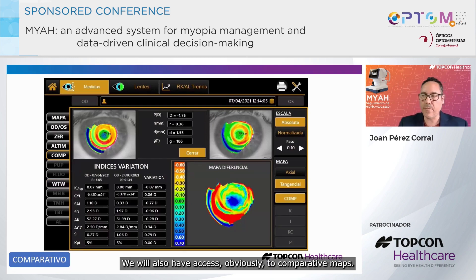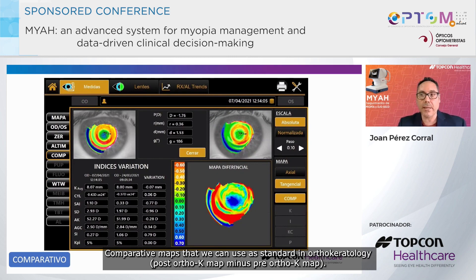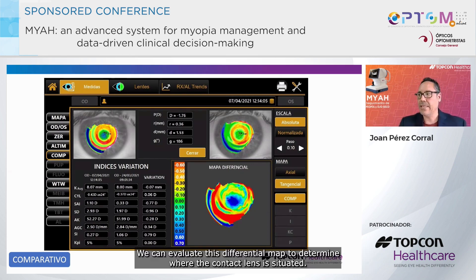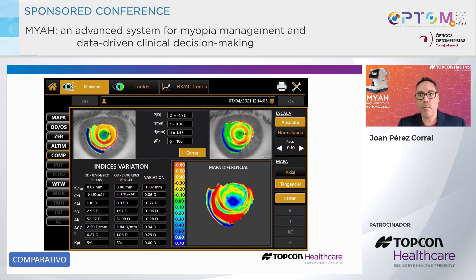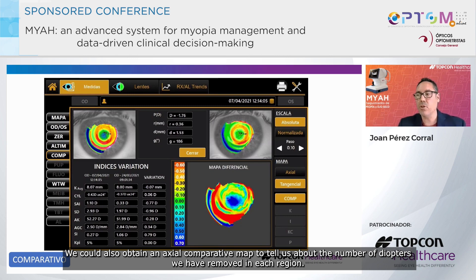We will also have access to comparative maps. Comparative maps that we can use as standard in orthokeratology: the post-orthok map minus the pre-orthok map. We can evaluate this differential map to determine where the contact lens is situated. We could also obtain an axial comparative map to tell us about the number of diopters we have removed in each region.